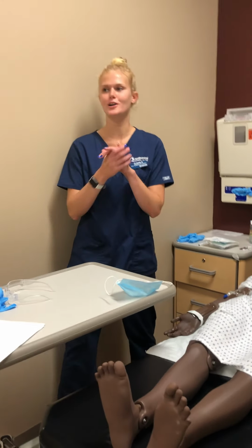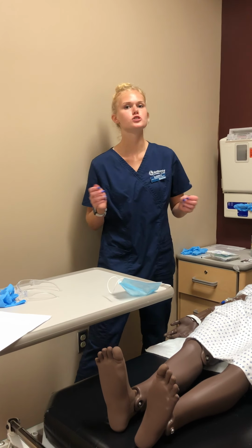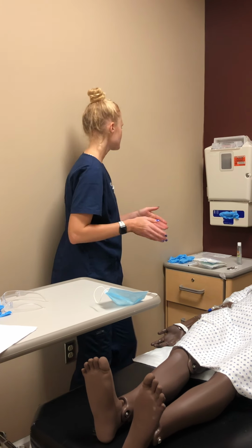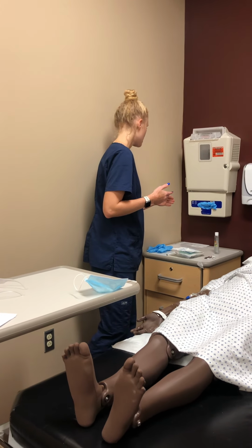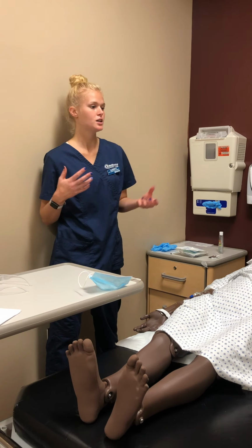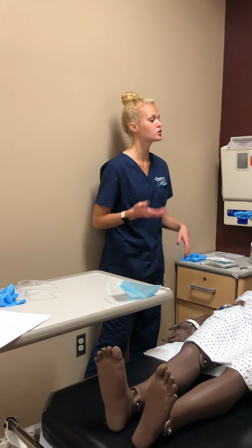Lexi. I'm going to go ahead and wash my hands. I'm your student nurse today, so I'm going to provide privacy. Today, I checked my MAR and made sure that we have an order for a central line dressing change. So what I'm going to do is ask, could you tell me your name and date of birth?